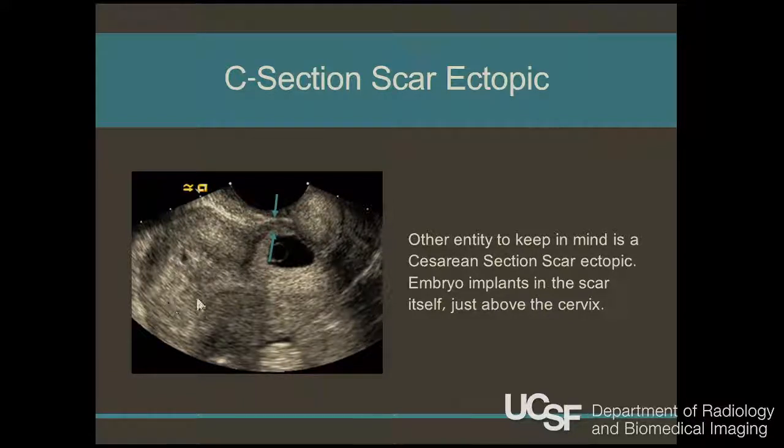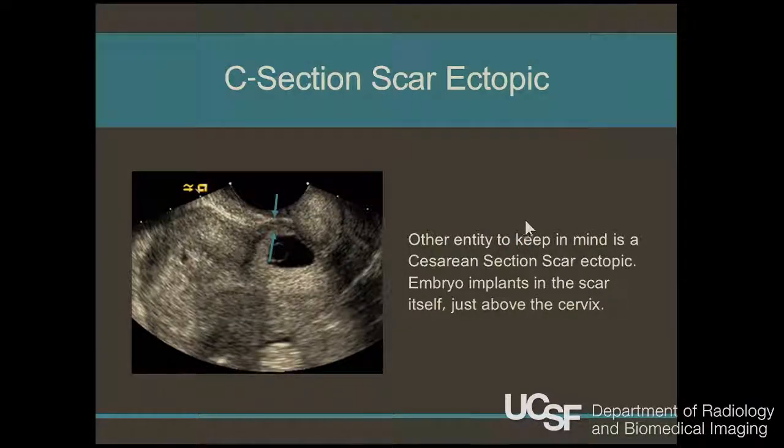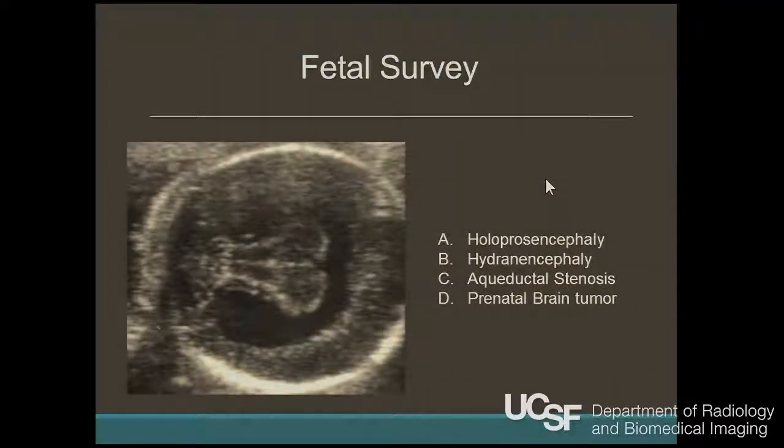So here's the endometrial canal, which is coming down like this, and this is eccentrically located anteriorly. And I could have superimposed this picture from yesterday, literally, they look like this almost every time, and you will see those, so it's important to know about.